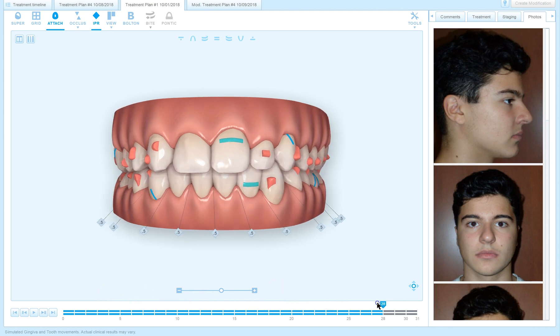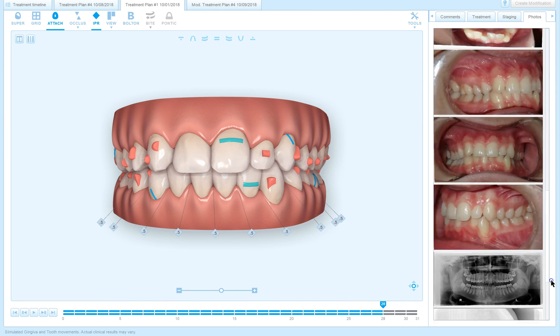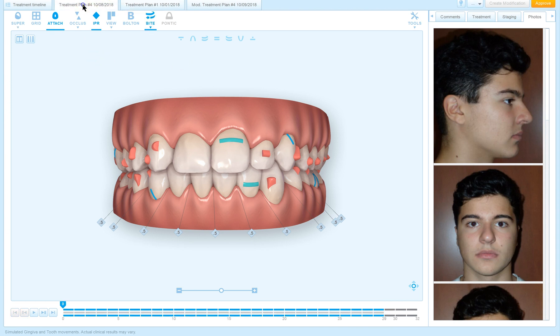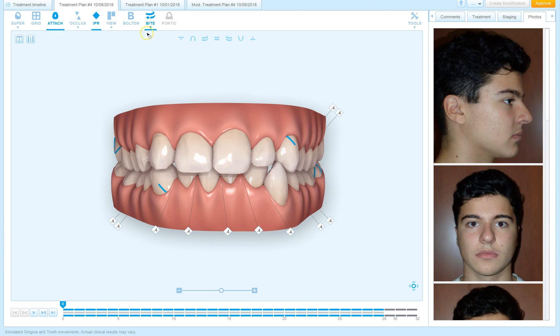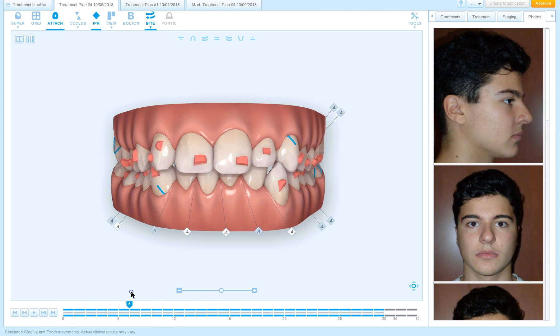Of course I have all my records here uploaded and I can do that. I'm not going to go through the whole details of why I have this plan, but what I want to talk about is the bite jump tool. You see here right now the bite jump is throughout treatment. What does that mean? Well, this gray bar is running through the middle of the ClinCheck, and as it moves it is assumed that my patient is going to be wearing class 3 elastics on the right side.